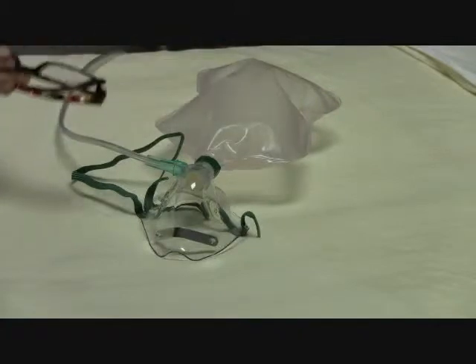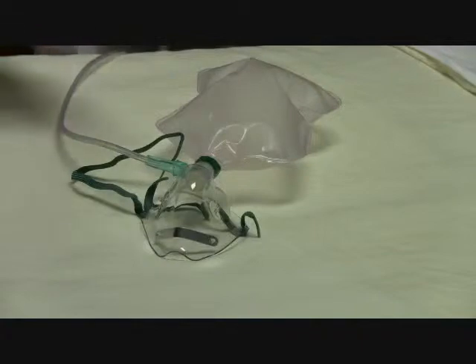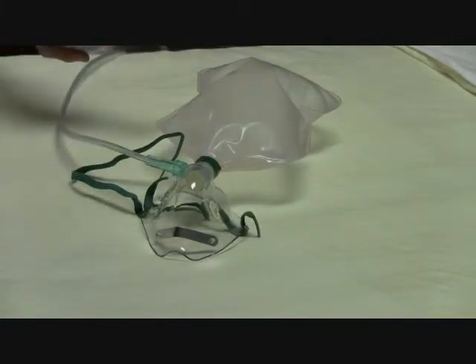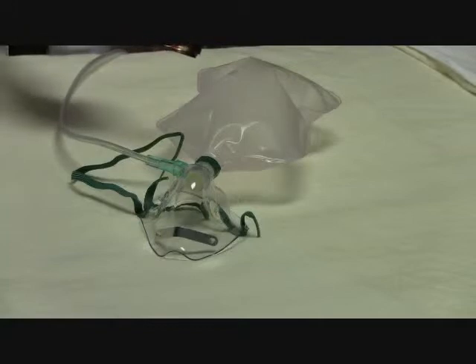The one-way valve will open on inhalation, and then on exhalation the valve will close. This prevents the patient from exhaling CO2 into the reservoir and decreasing the amount of the FiO2 concentration.